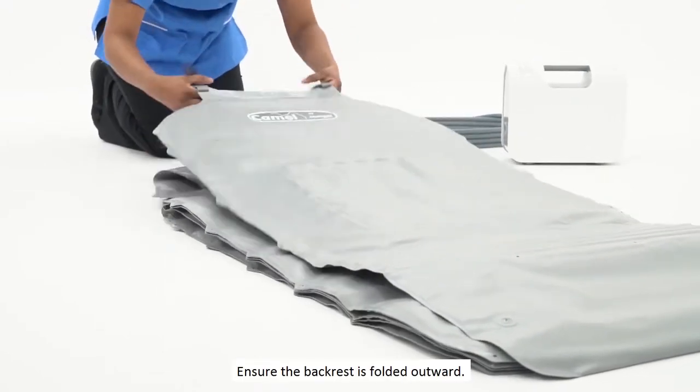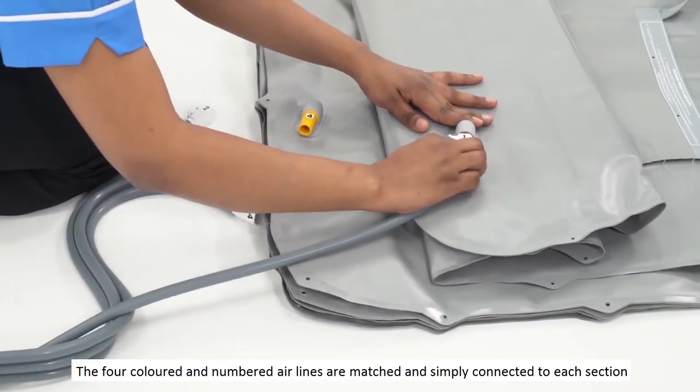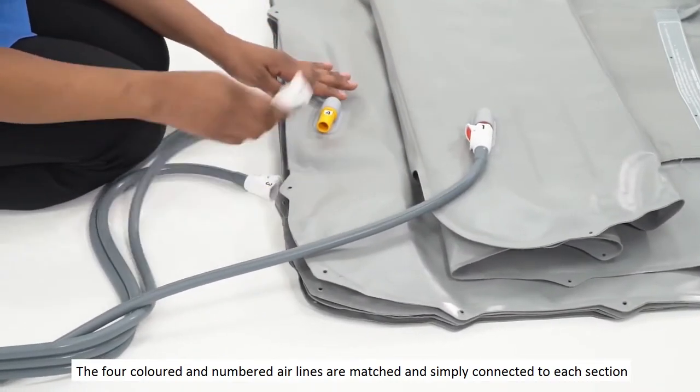Ensure the backrest is folded outward. The four coloured and numbered airlines are matched and simply connected to each section of the Camel.